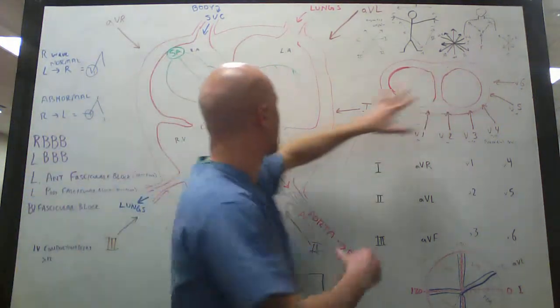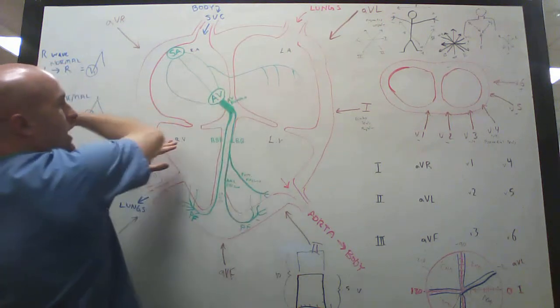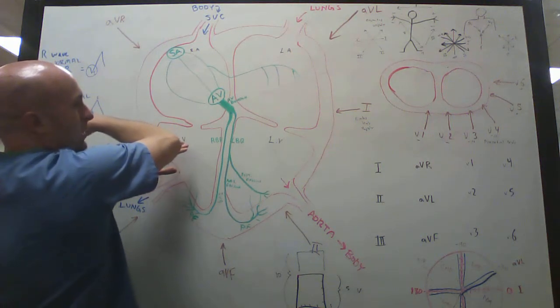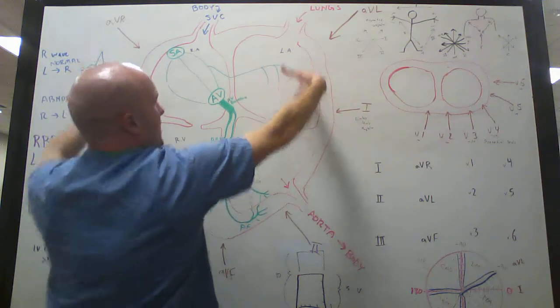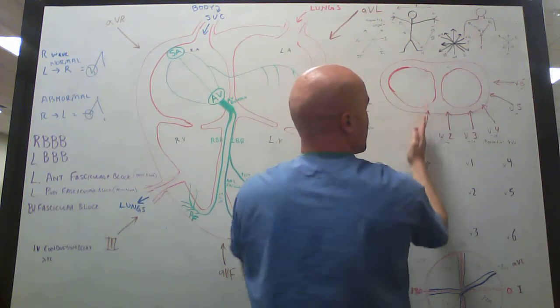But it's taking an image like this. So we just took the heart, this is an up and down kind of cut like this. Now we're taking it and we're getting a new readout on it. So we're taking this and plopping it on the side like this. So now we're seeing those holes like this. So this first one's taking this angle here.